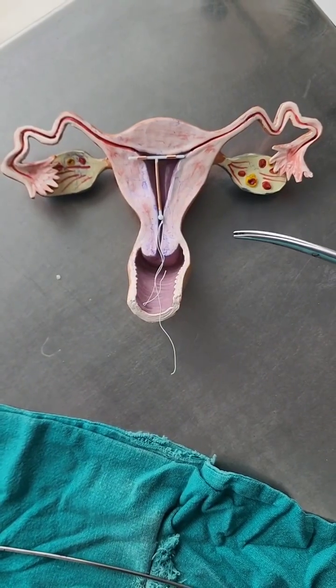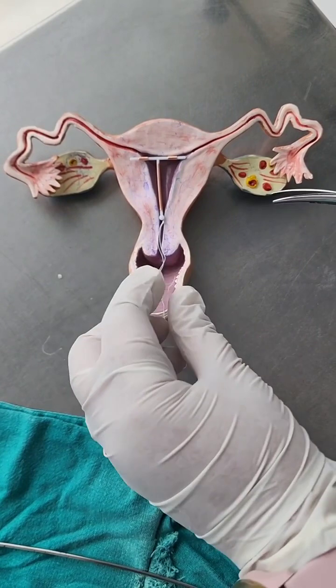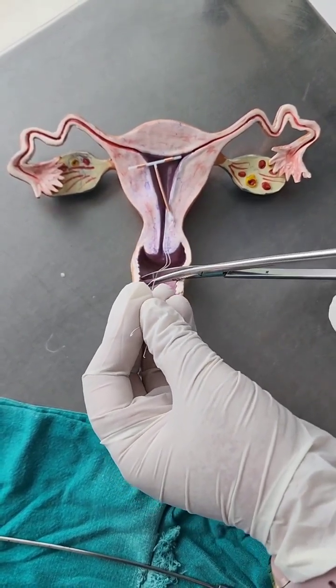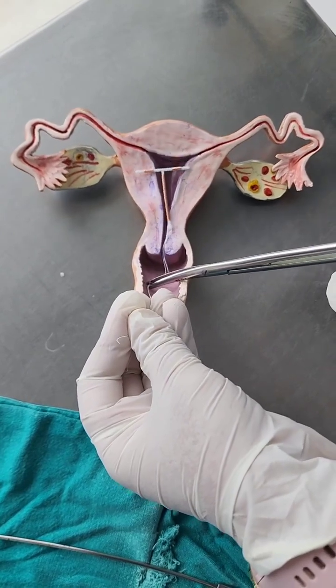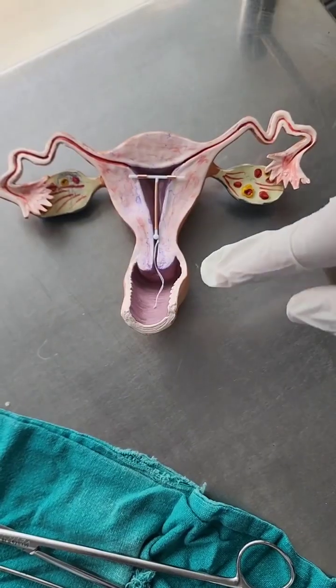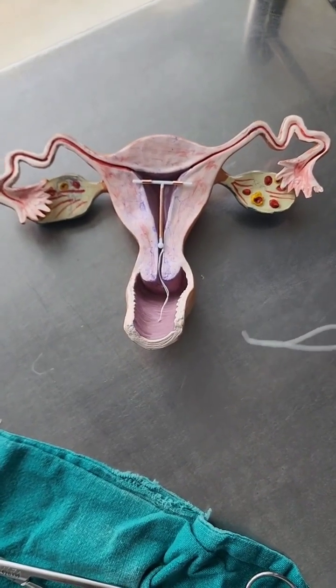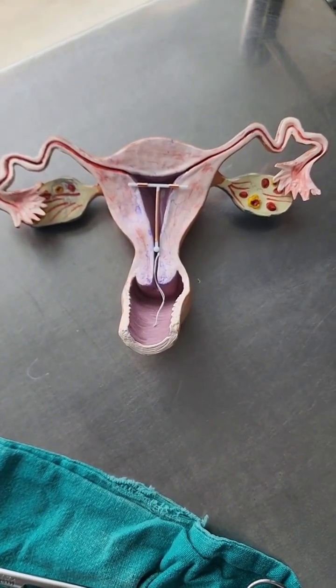The copper T is now inserted inside the uterine cavity. In the end, we cut off the thread so that we retain around 2.5 centimeters of thread beyond the os. This is the copper T with the cut thread, and we let the patient feel the copper T thread so she knows how to check for the copper T.